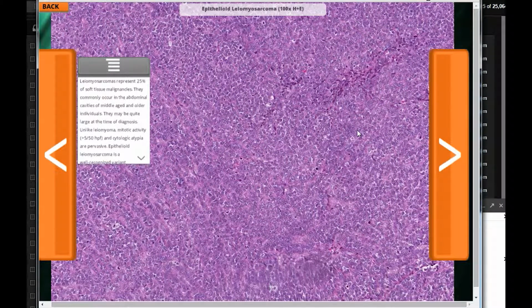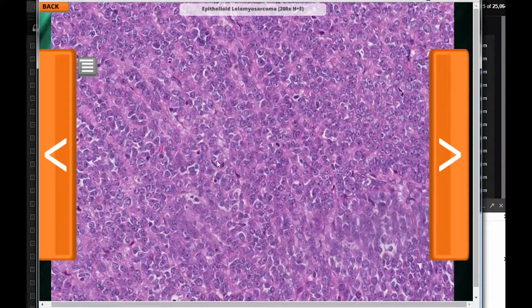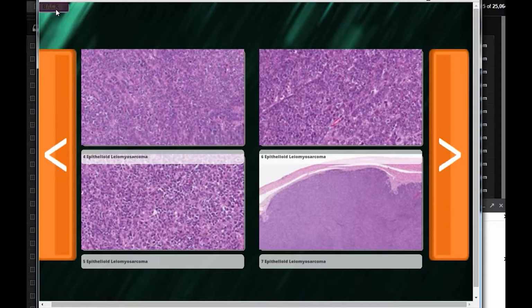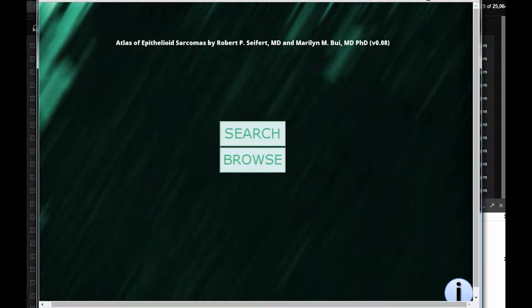It's all pretty simple, but what makes our platform relevant is that you, the end user, can download our template, take out our images and diagnoses, and put in your own. You do not need to have any programming knowledge. You just need to be literate in basic Excel and basic PC functions. I will now walk you through this process.